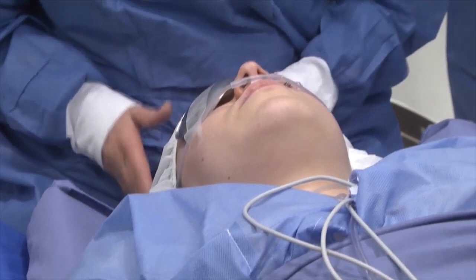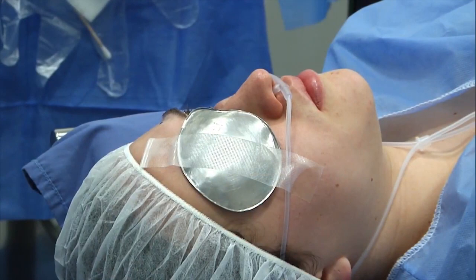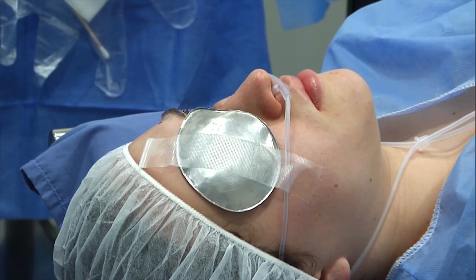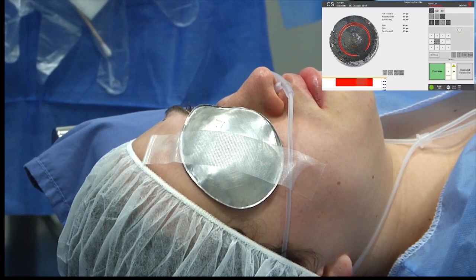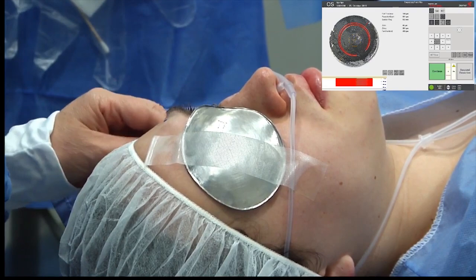It's like a kind of trench. If you see, it's not a wedge resection, it's a disruption of parallel faces. And now what we have to do is make the resection of the tissue that is between the canals. Okay, let's go to the other room to remove the tissues, and I will show you how in this case we do that.